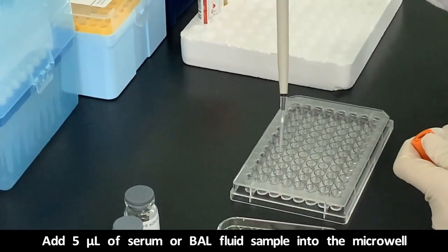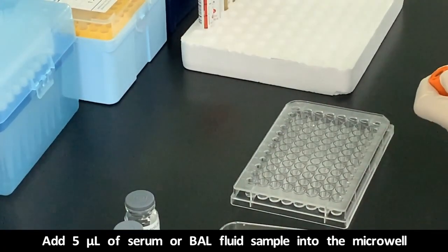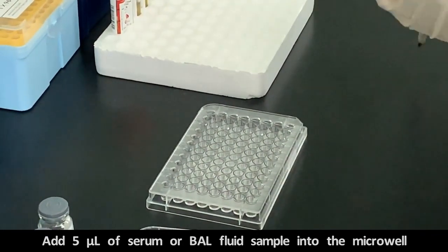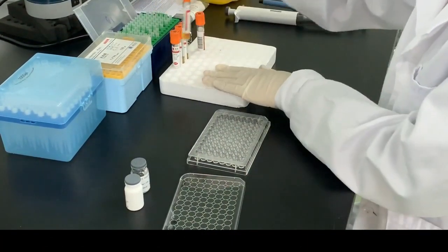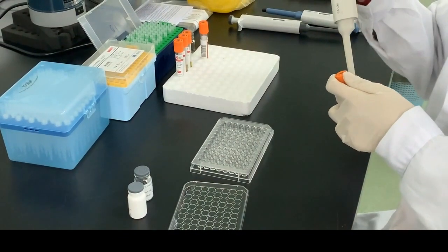Clearly the accuracy of this pipetting is important, and a glucan-free pipette and pipette tip are important as well. Usually these are done in duplicate, but this isn't absolutely necessary. Ensure that you've labelled which sample goes into which well so that you can interpret the results correctly when the assay is complete.